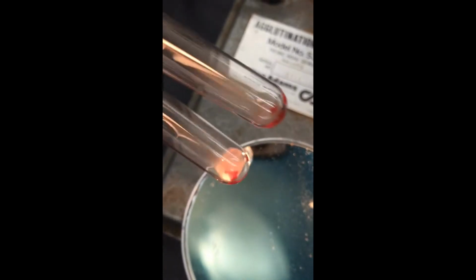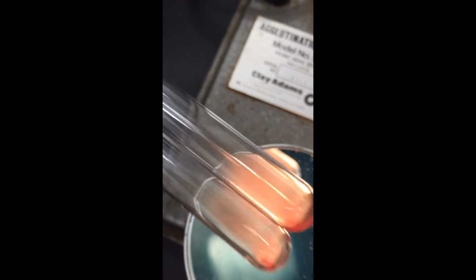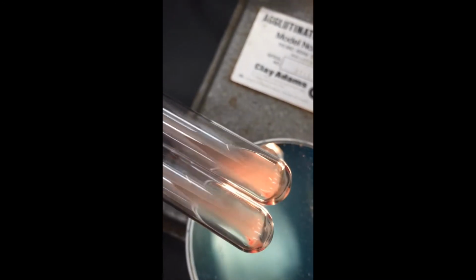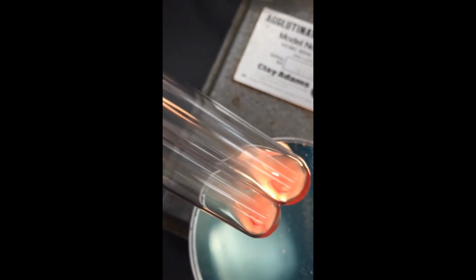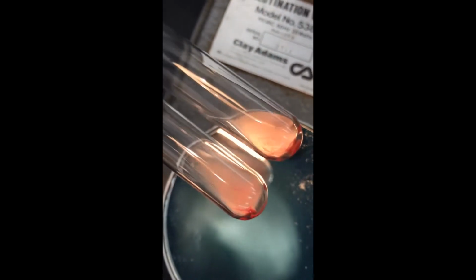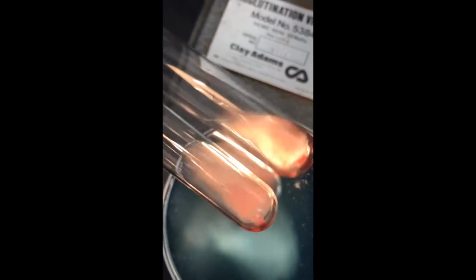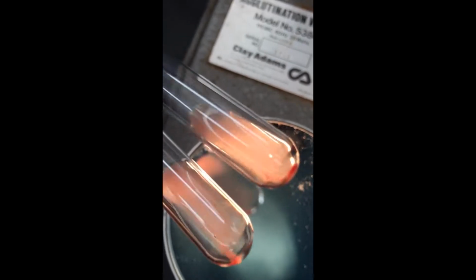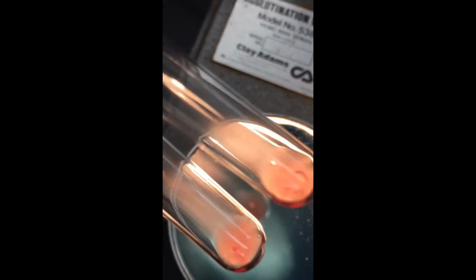You see the swirling pattern as the cells come off the button in the bottom. Okay, and 9 and 10. Bottom is 9. Top is 10.